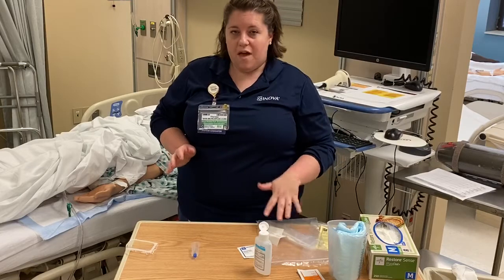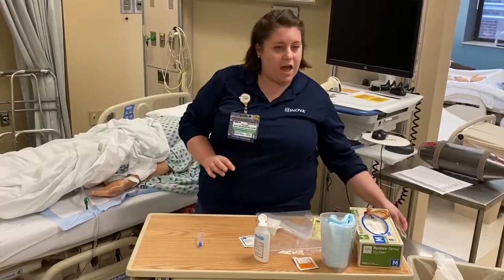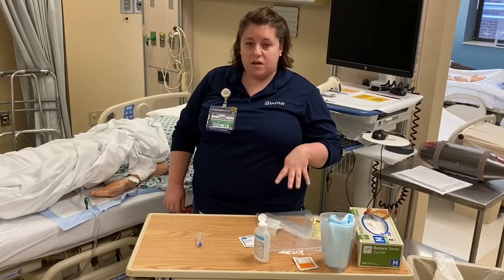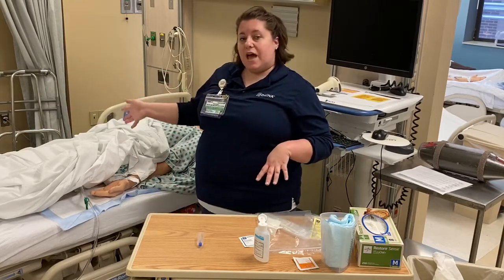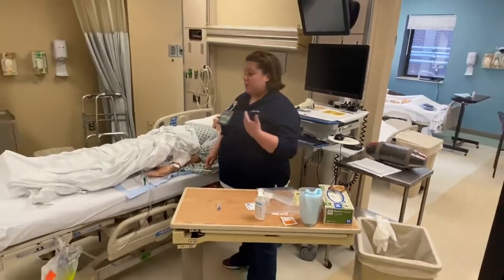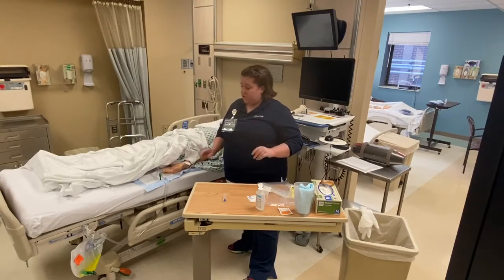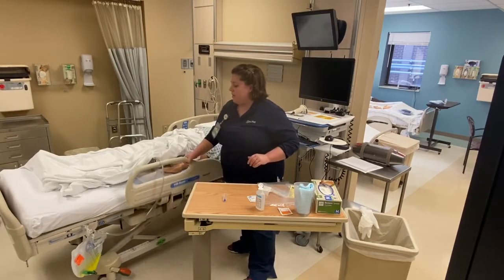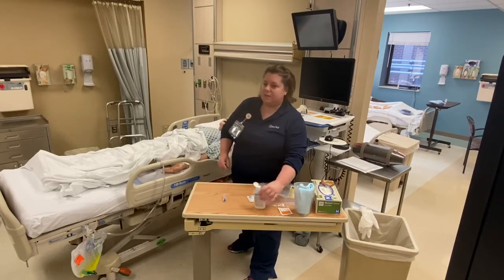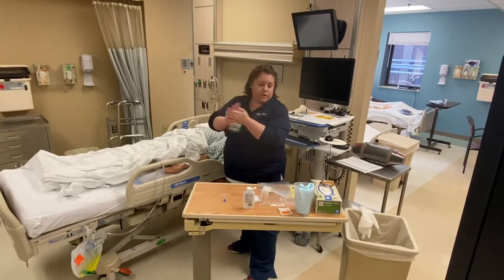At this point though, I'm actually going to finish up in the room, so I need to clean up all of my supplies, and I'm gonna show you how to empty the urine from the Foley bag, okay? So, my patient's bed is still in a high position, which is actually gonna make it easier for me to empty the Foley bag, and I'm close enough to my patient that she's safe, but to be extra cautious, I'm going to put this side rail up while I empty the Foley bag, just to make sure she does not fall, since the bed's in the highest position. So I'm gonna wash my hands again and put some gloves on.